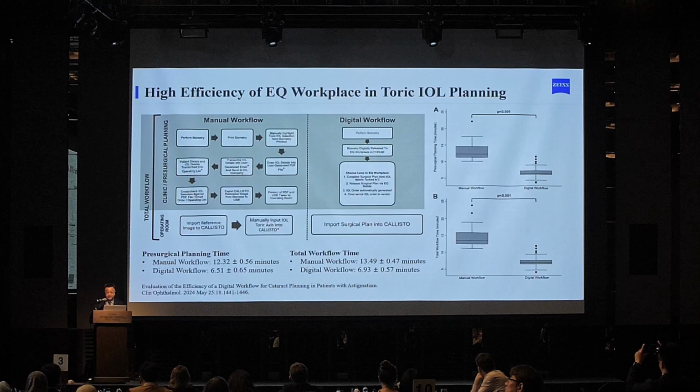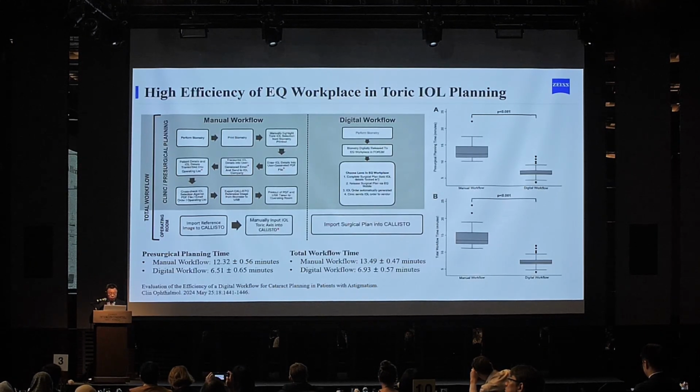A published study shows that the digital cataract workflow is more efficient and provides slight cost savings compared to the manual workflow, especially when planning for toric intraocular lens implantation.